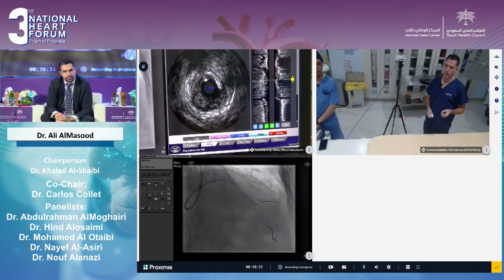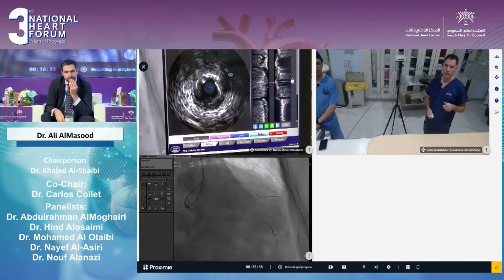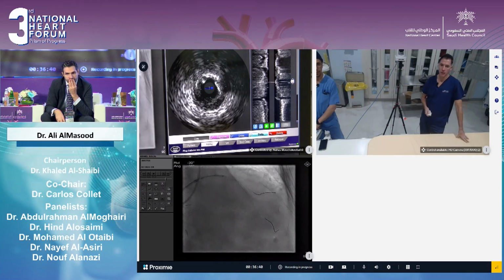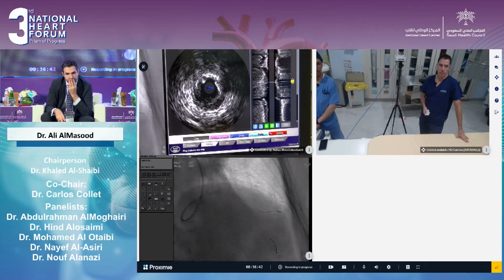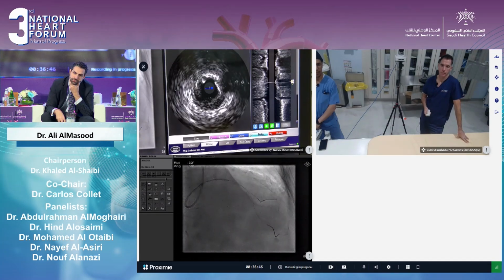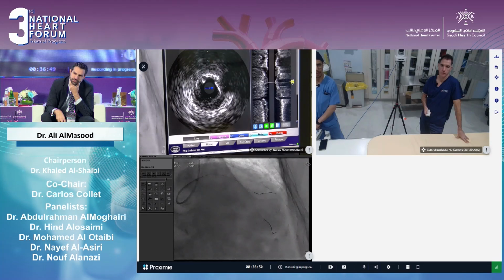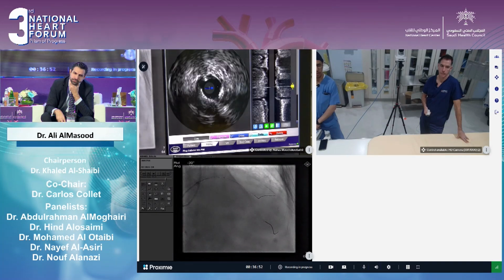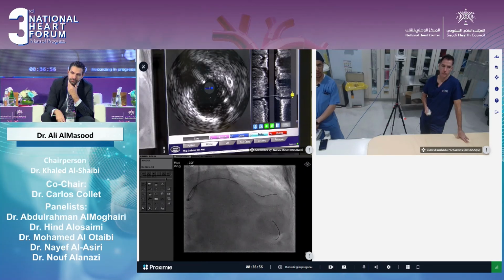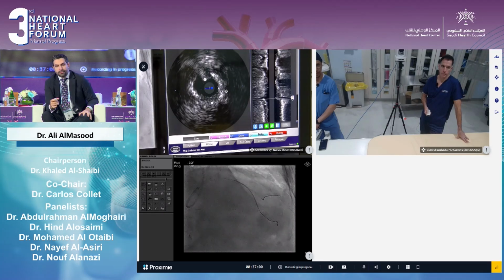With the volume of atheroma and the extent of the atheroma, we felt that stents were needed. We didn't see a good landing zone for one stent without having to go beyond that diagonal. So you can appreciate the run of the IVUS after the NC balloon. You see the fracture of the calcium, so it was not difficult to deal with the calcium by NC balloon. That's why we did not consider using shockwave or other calcium modifying tools. Most of the calcium gets fractured with the NC balloon.